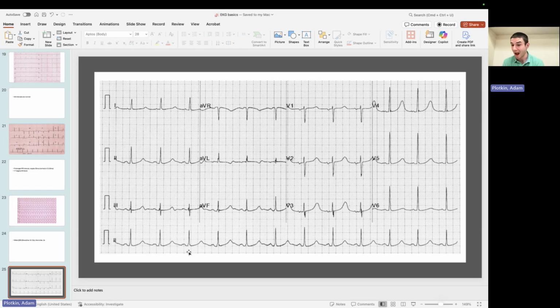So I would look up, if you have learned about torsades, you can definitely look up a picture. I wasn't sure if you did. It's pretty obvious when it's torsades. You get these wide complex tachycardias that look like they're literally twisting over the points. But we get worried about that. You guys have probably learned about several drugs that can prolong the QT. Whenever you see torsades de pointes, twisting of the points, wide complex tachycardia, it's polymorphic ventricular tachycardia. I think I said paroxysmal earlier. Sorry, that was a mistake on my part. It's polymorphic ventricular tachycardia. Polymorphic just means multiple different types.